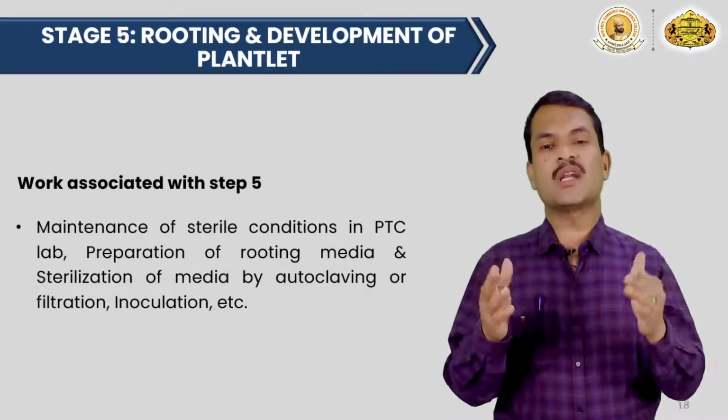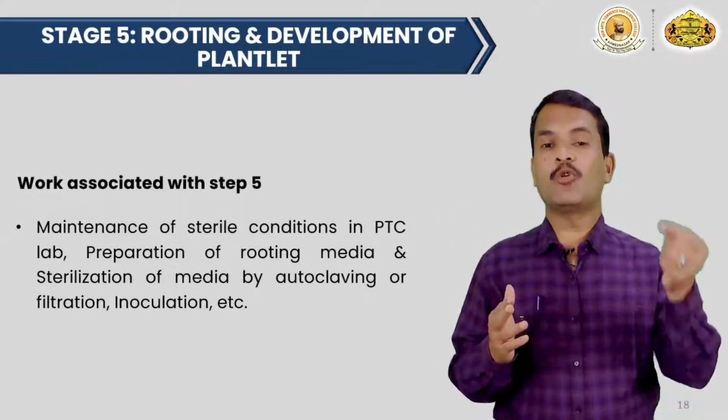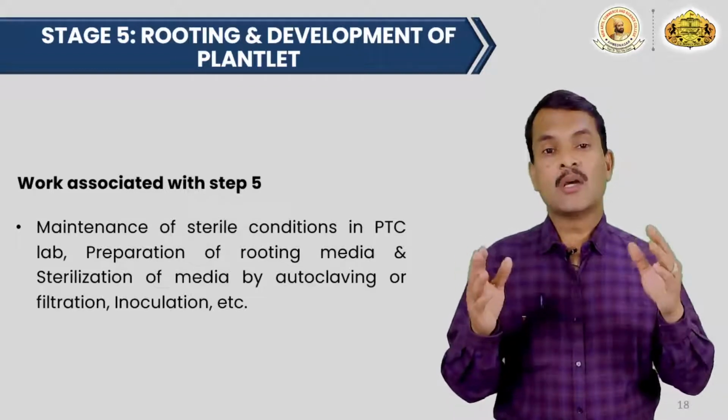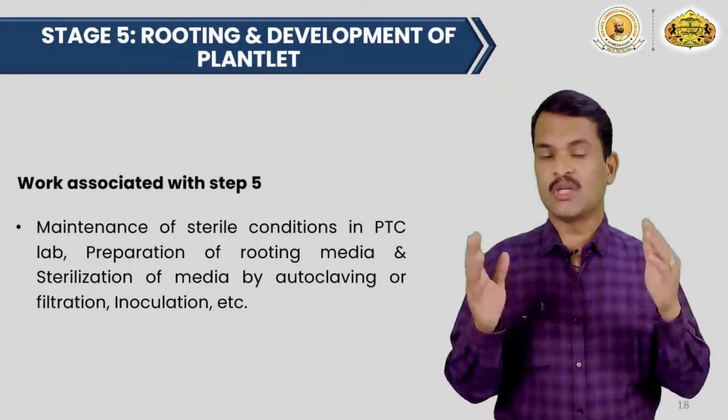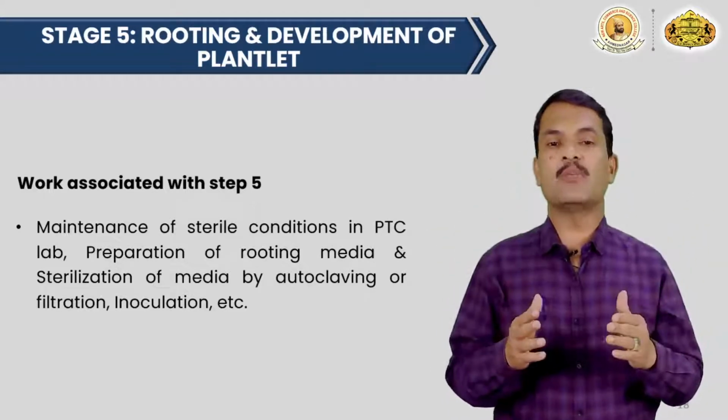Work associated with this step will be the maintenance of sterile conditions again. If any bottle is contaminated by chance or by mistake, you need to remove it, you need to autoclave it, you need to destroy it, remember. That is also a very important thing.